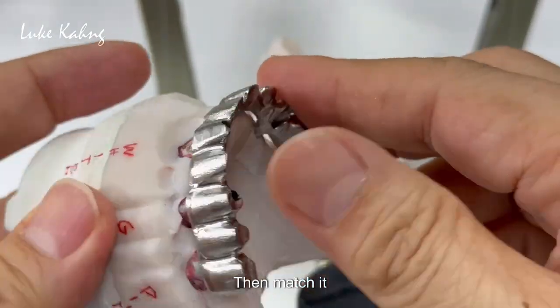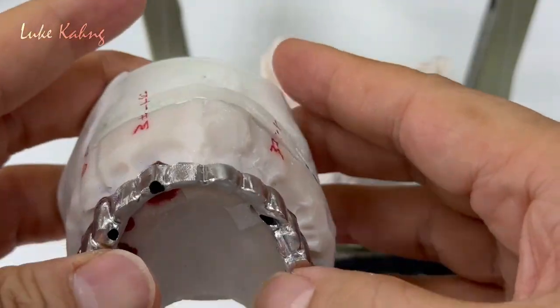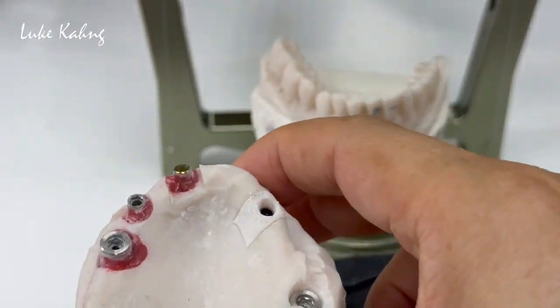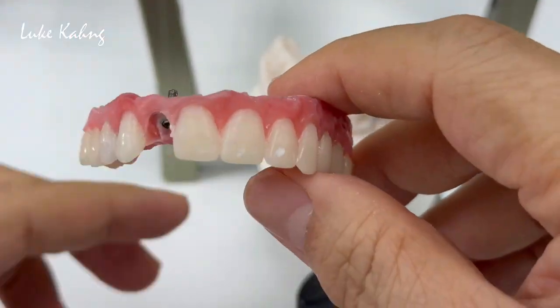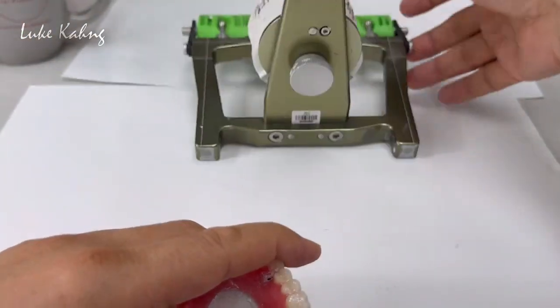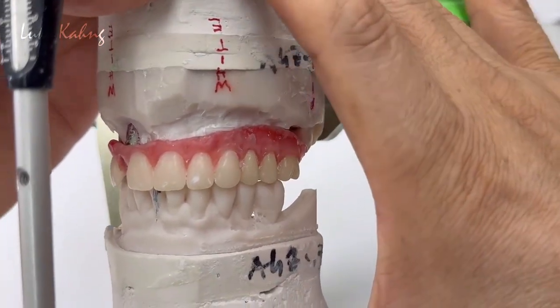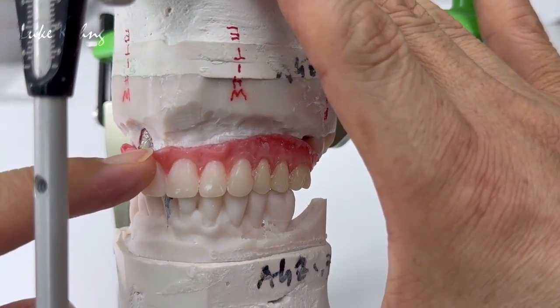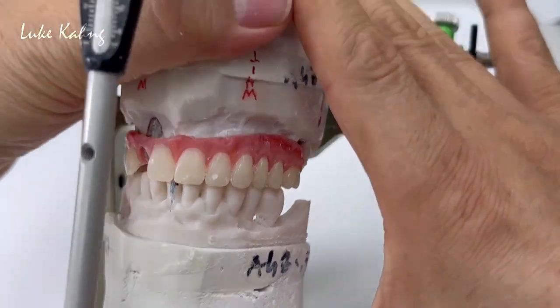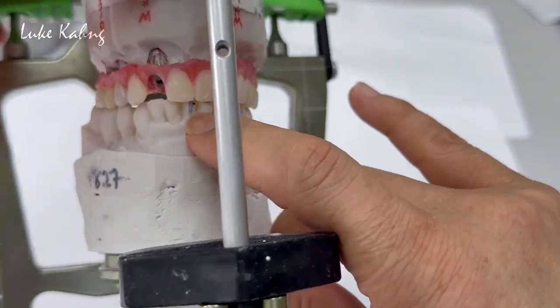Then match it and use the three different screwdrivers. The game plan was here — try-in wax, trying to get the information between the tissue and the bite. This is very imperative; the option is very important to set the tissue height and incisor length, incisor position. I mark it with a pencil and the midline here, which is a little bit off definitely.